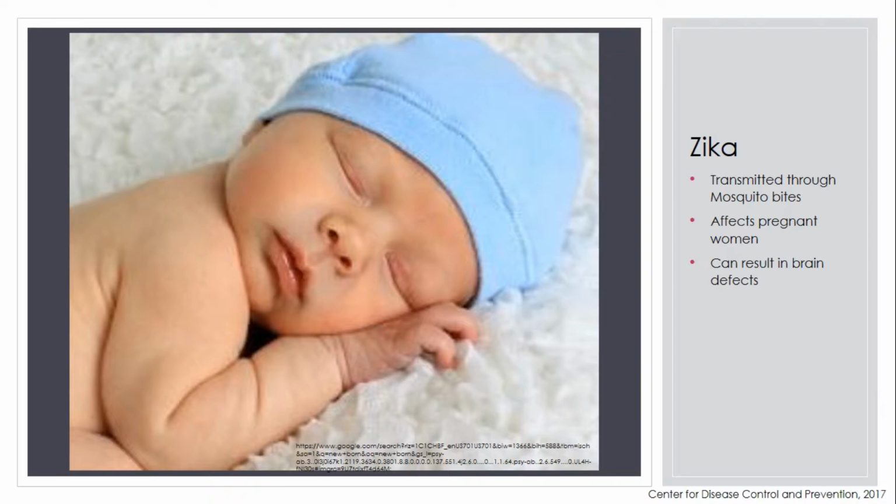Because of this, the CDC, or Center for Disease Control and Prevention, has begun to require a neonatal brain ultrasound prior to discharge in all infants born to a mother with the Zika virus. This, in turn, requires our ultrasound department to perform these studies.